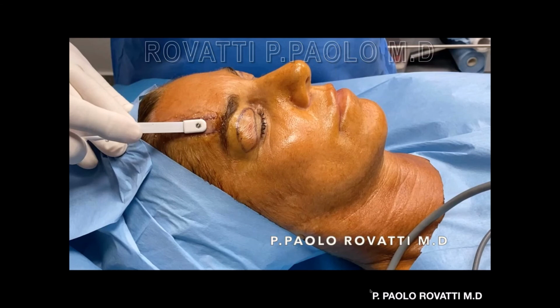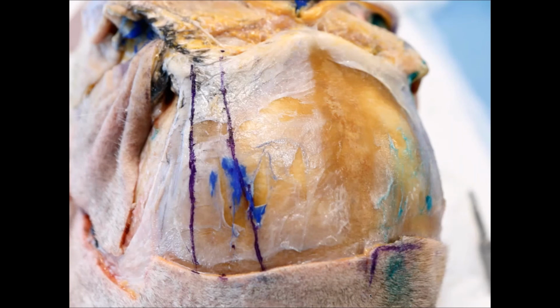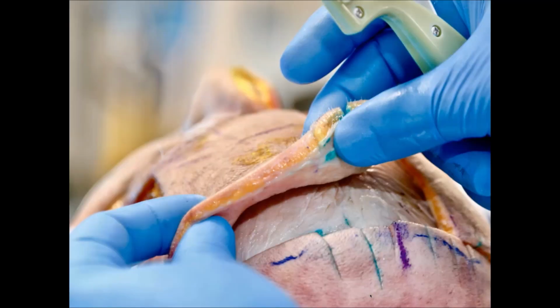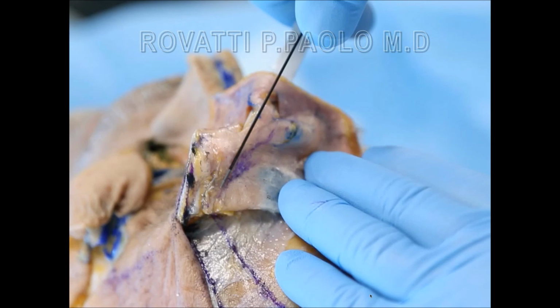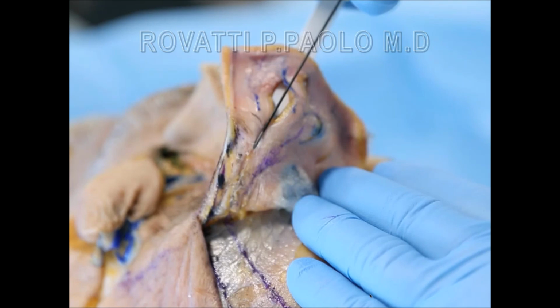This is the area where we are treating above, and this is the depth, the thickness that you can see. You can see the muscles and the fat. I think you know that there is a little layer of fat below, and this is our safe place to put our device. Look what happens if you don't treat the fat, but I'm treating the muscles. This is the frontalis muscle. You can see I'm treating, you have a little contraction. Okay, this is the cadaver, but you can see that it is not a great contraction, so you don't have a paradoxical effect.